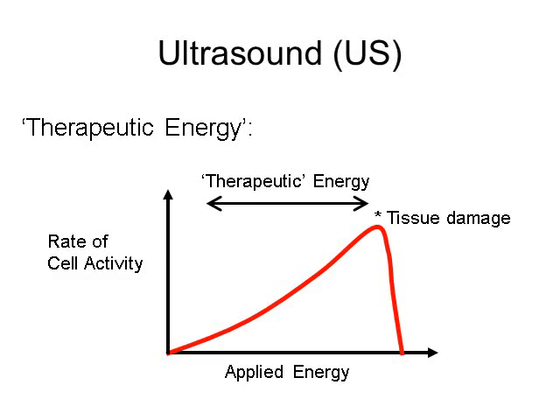This therapeutic level of energy is, as you can imagine, difficult to judge, and your observation and assessment of the patient is critical in judging where on this graph you are. Precisely the same issue is present when considering the application of manual techniques to the body.